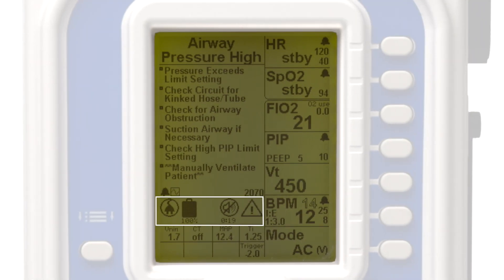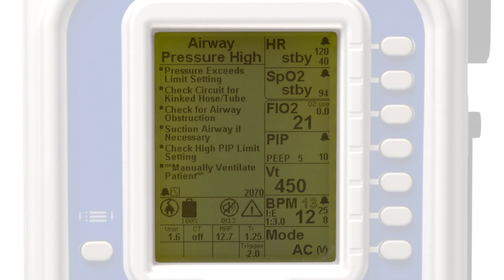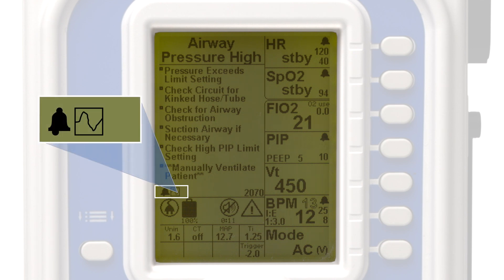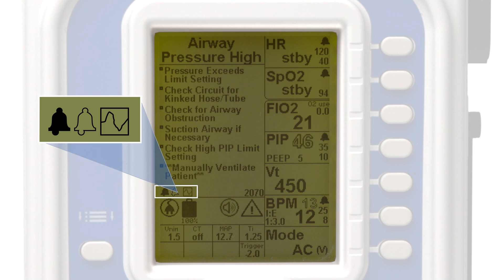Directly below the Smart Help message area is the icon tray, which displays key icons and notifications. In the small row at the top of the icon tray, an alarm bell will appear indicating an active alarm. The number of bells corresponds to the number of currently active alarms. A solid bell indicates the current alarm that is displayed on screen, and an outlined bell indicates additional alarms that are active but not currently displayed.